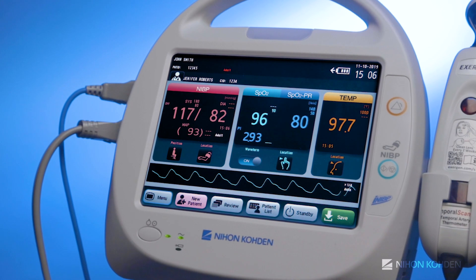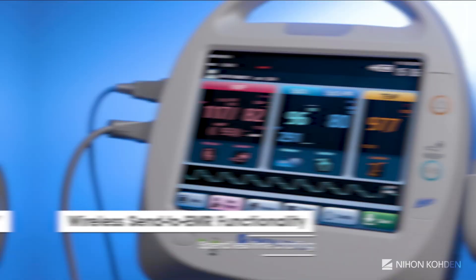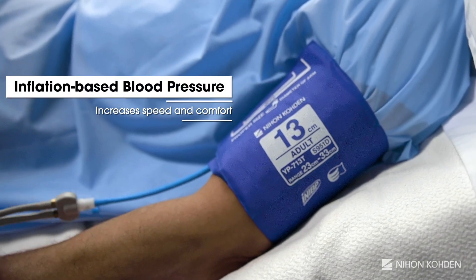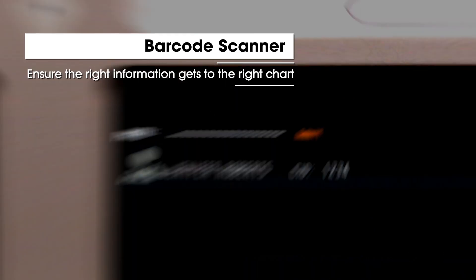Each monitor comes complete with wireless Send to EMR functionality and inflation-based blood pressure measurement. It can also be outfitted with an optional barcode scanner for efficient and accurate patient admissions.